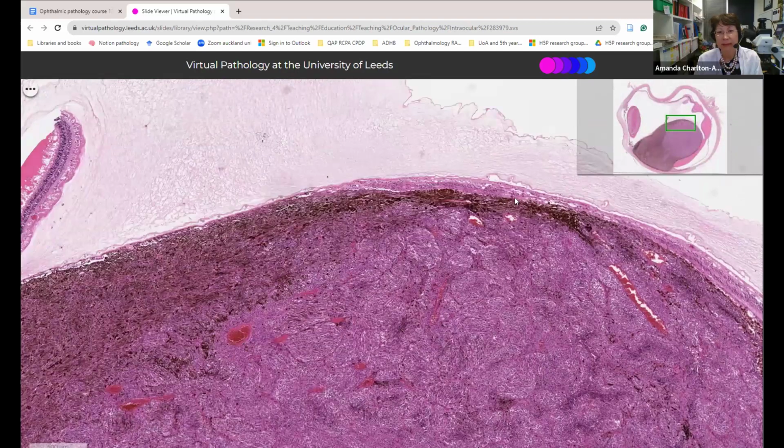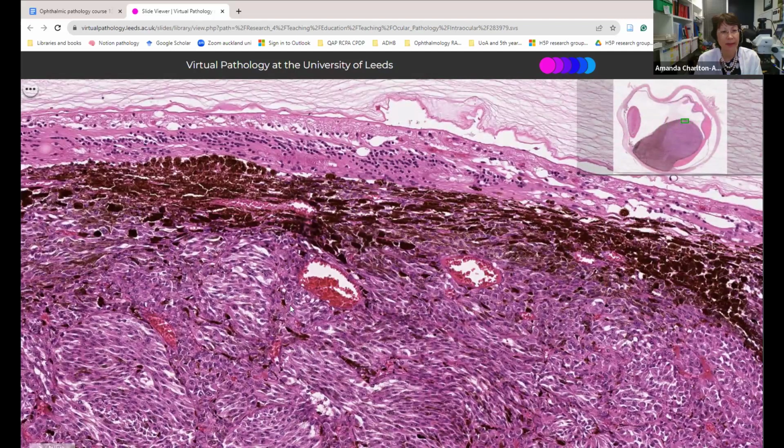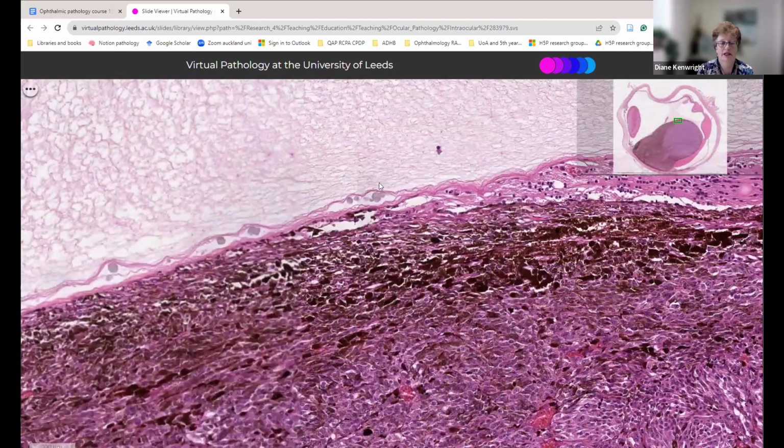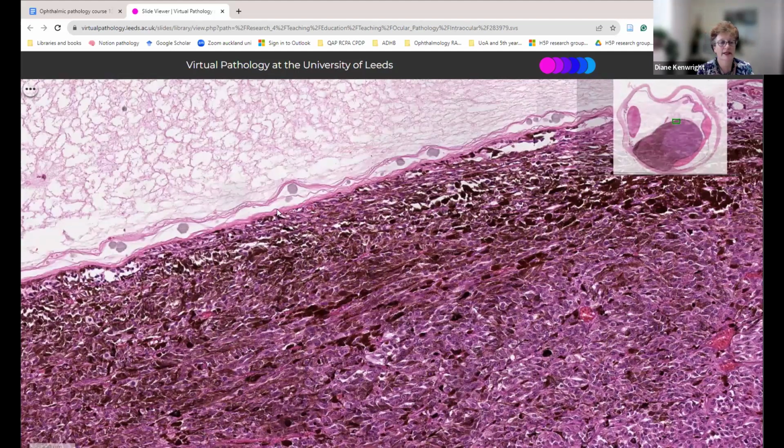All right, just so we can see the retina overlying it, and the retina is quite attenuated over the top because of the pressure. Can we move to the left, please, Amanda? This way? Anteriorly? Yeah, anteriorly. Sorry, I should have used anatomical terms. I see that Bruch's membrane through there is looking fairly intact. It's that line, isn't it?